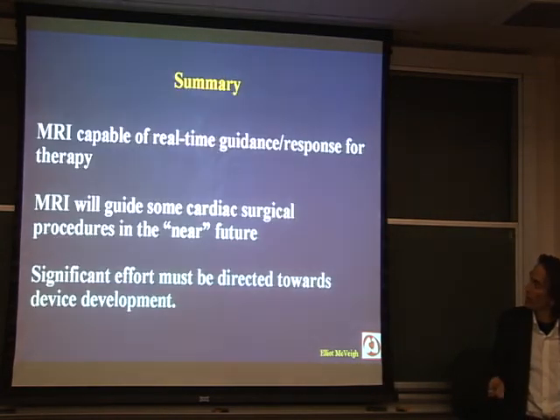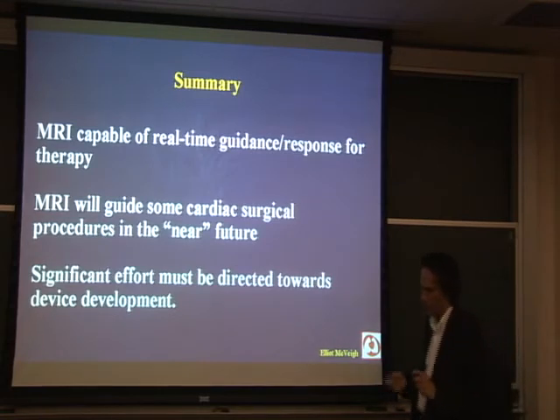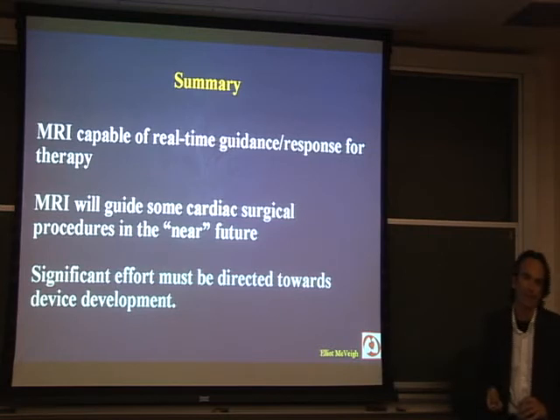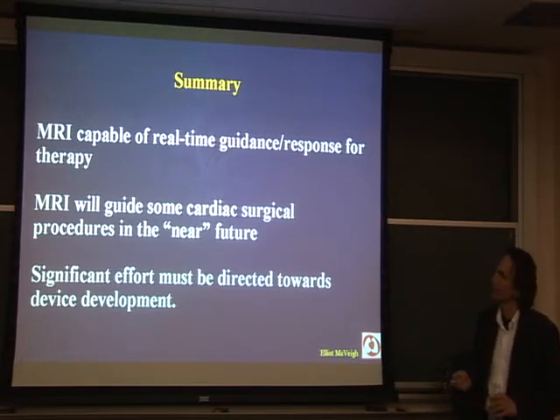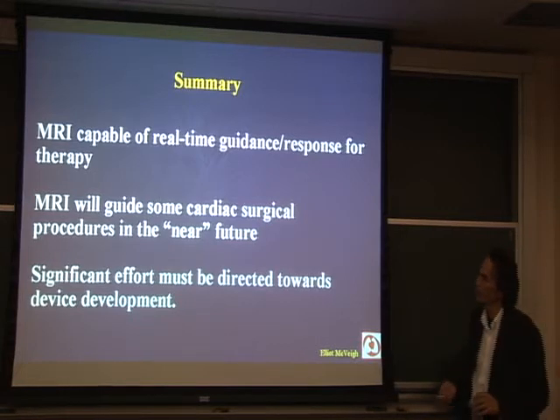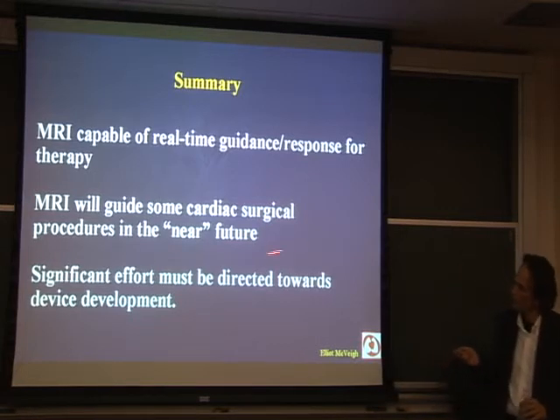So we're now looking at putting these valves in, in these acute experiments, and sending things back to the farm and taking them out for chronic studies. So just to sum up, MR is a great technique now, I think, for real-time imaging, specifically when you want to see what you're going to do with tissue. When you want to ablate tissue, inject something in tissue, do anything, but you want to see that effect. And I think there are certain surgical procedures that we're going to be able to help.